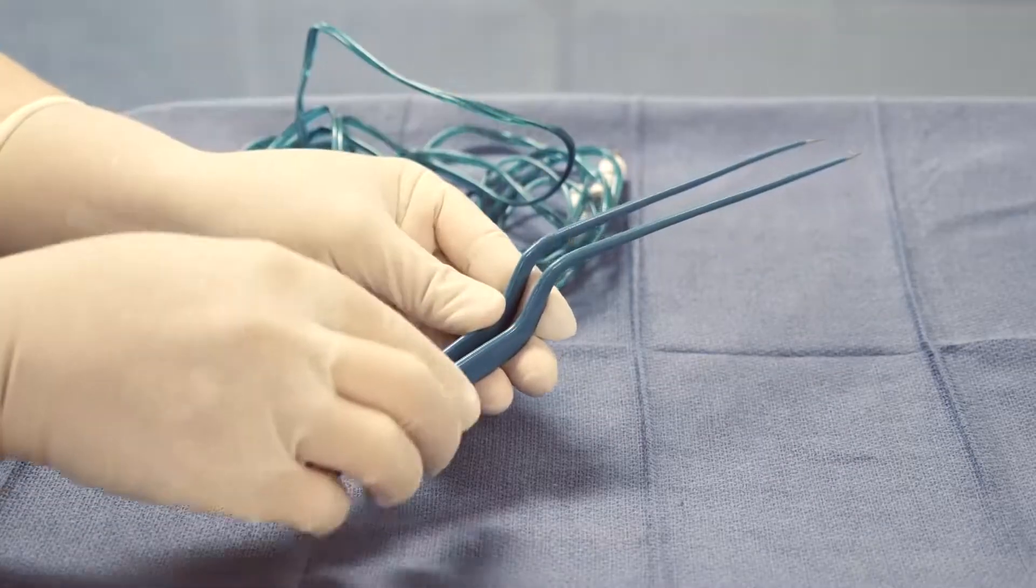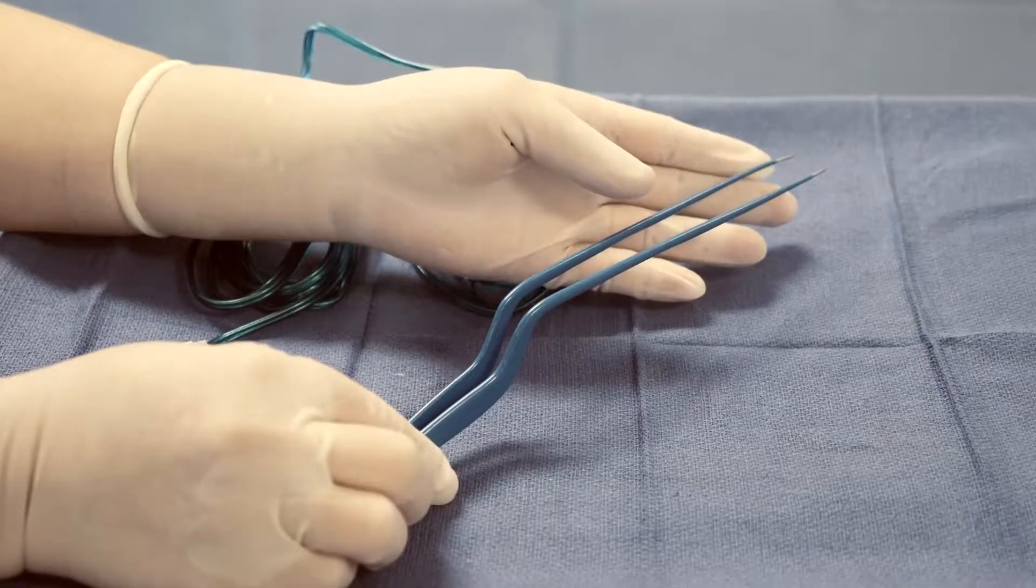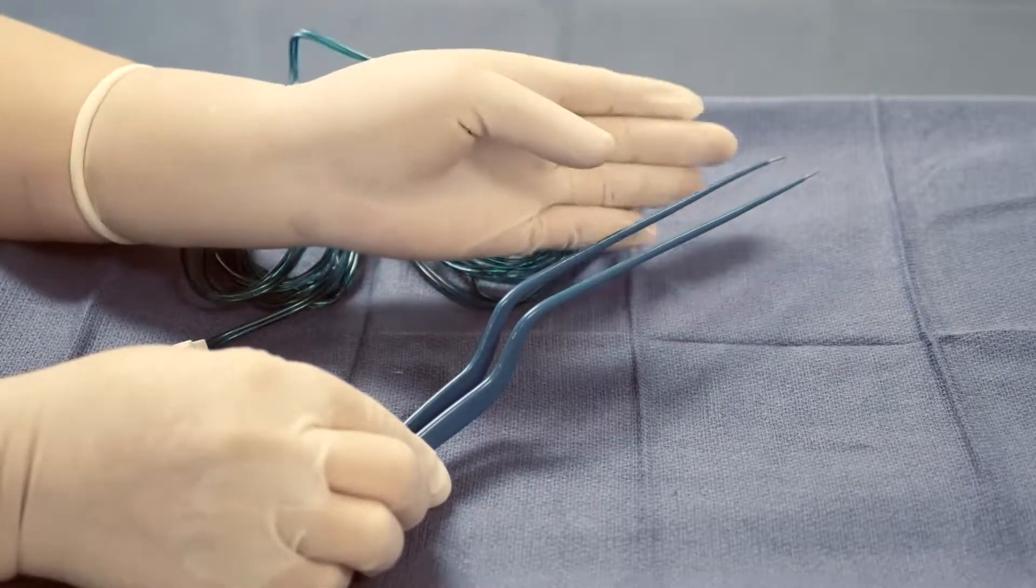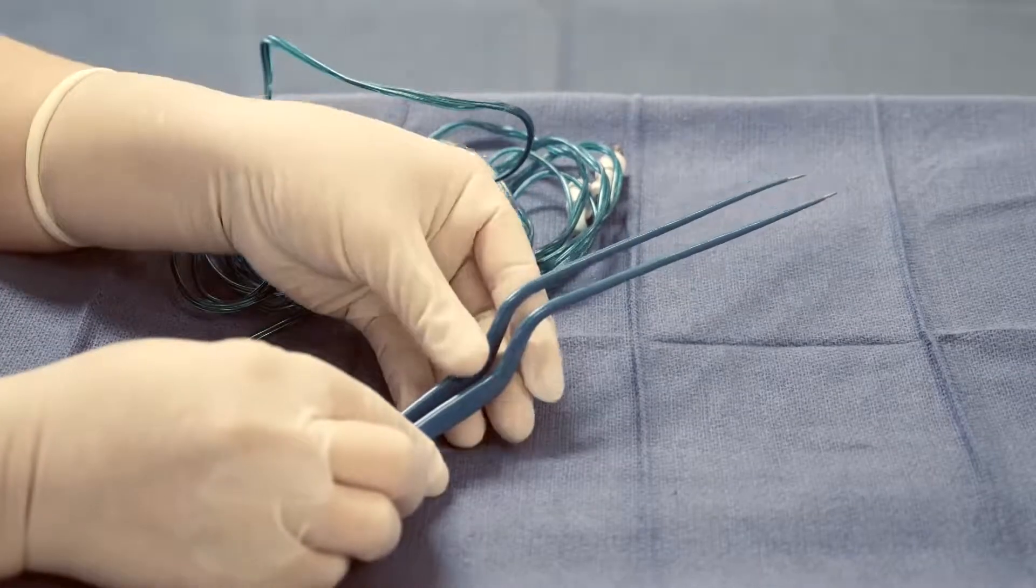This allows the surgeon to cauterize any tissue between these two tips. To enable its bipolar capabilities, the bipolar or bayonet forceps needs a cord.